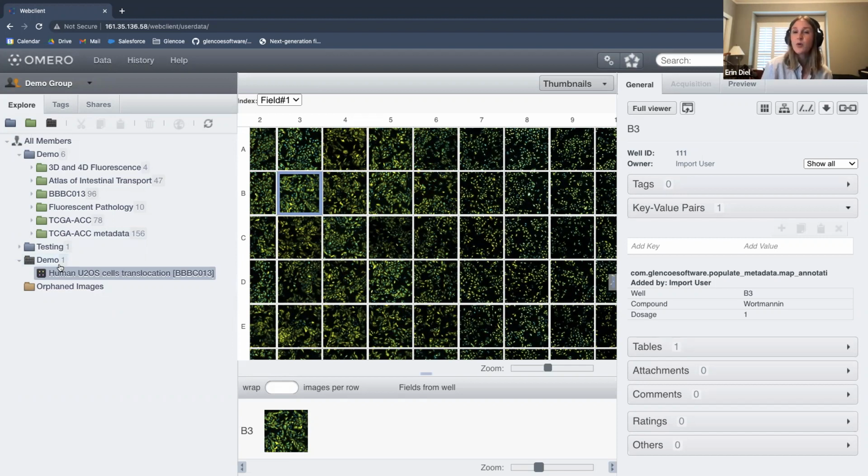Great. So separate hierarchy, screens and plates. I want to talk about next probably how we can get to the viewers from here. If there's no questions, I want to give everyone the chance if there's any questions on this metadata. I don't want to go too fast through it. Is everything clear in terms of what metadata you can add and how you can organize data?